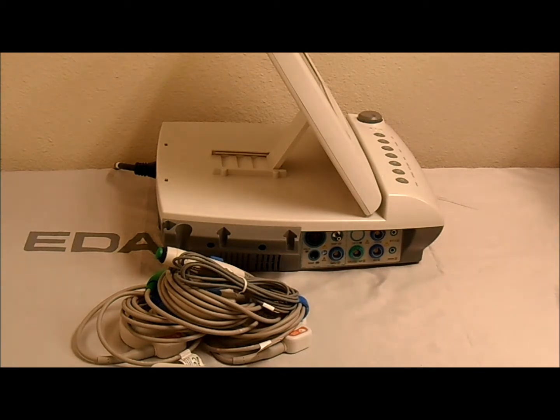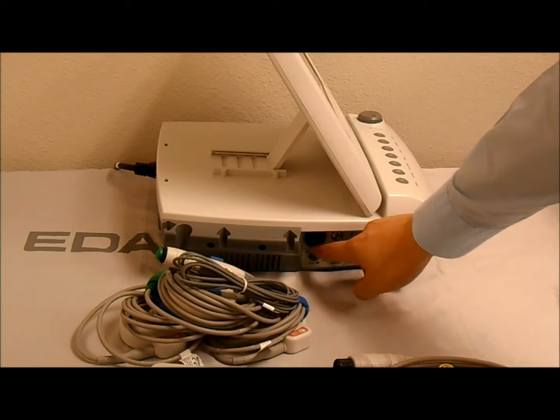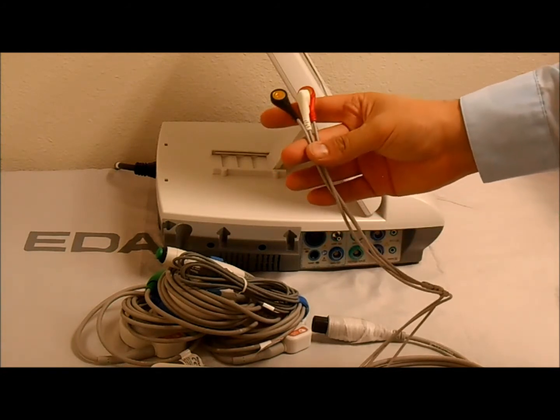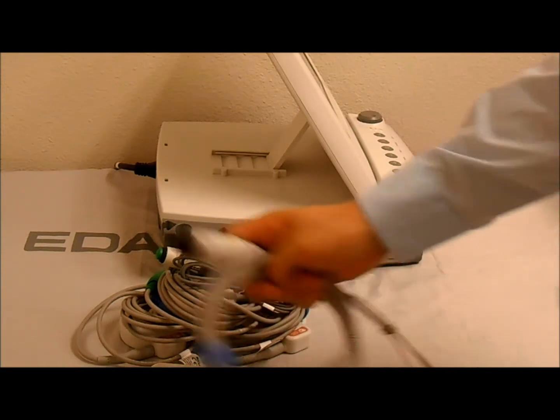Next, we have the 3-lead ECG cable. This connects on the MECG port, which stands for Mother ECG, and it's a 3-lead cable. So this you would place on the chest of the patient to get the maternal ECG.